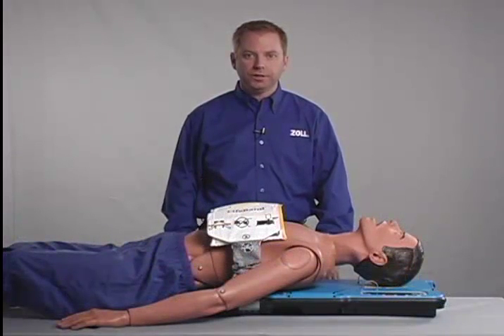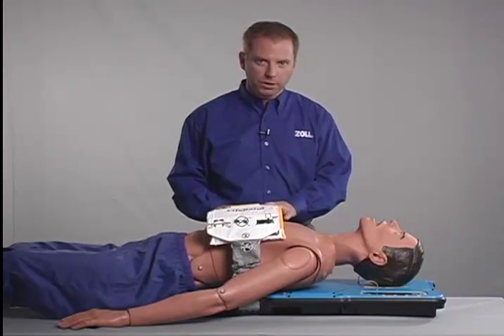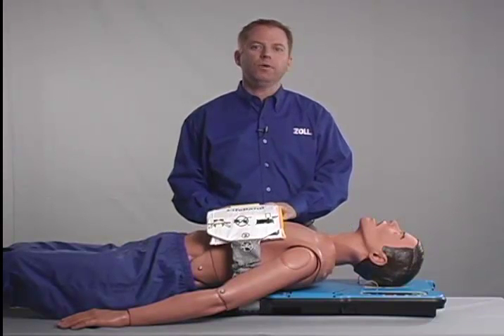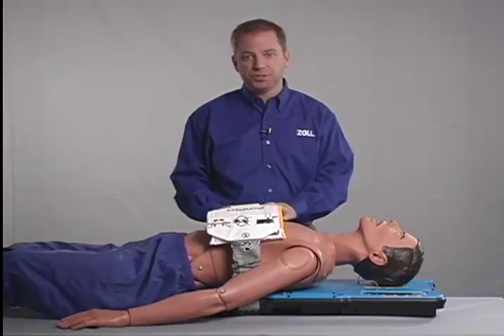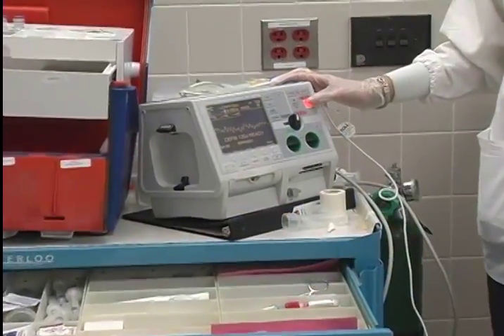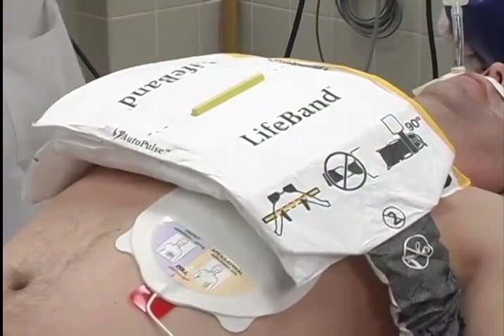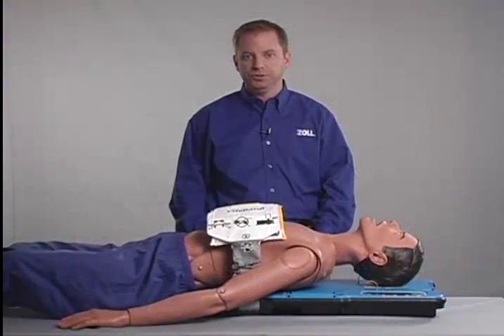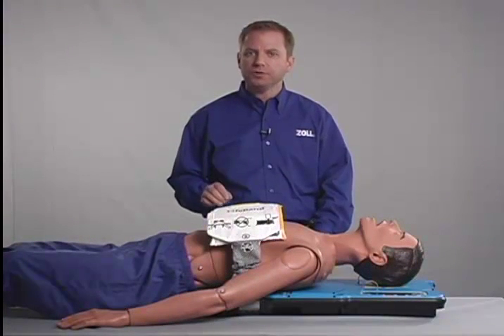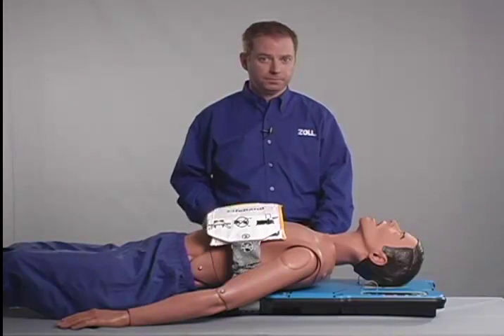In order to deploy the autopulse quickly and with the least interruption in compressions, a pit crew model, similar to that which is used in auto racing, is suggested for the responsibilities and positions of the staff members involved in using the autopulse and a defibrillator. Since the introduction of the autopulse, it has become clear that those organizations most successful in using it have a very detailed deployment plan to which they consistently train, follow, and monitor. The pit crew method represents an efficient method of utilizing all available resources.